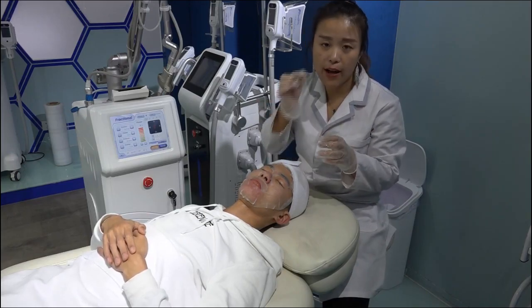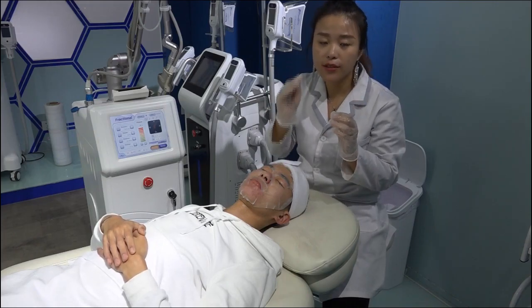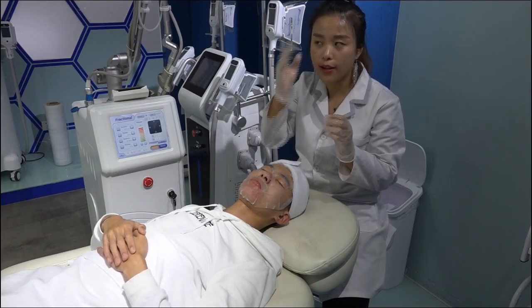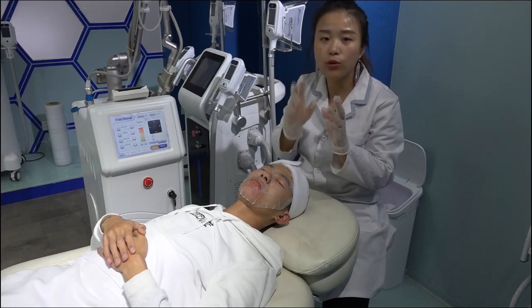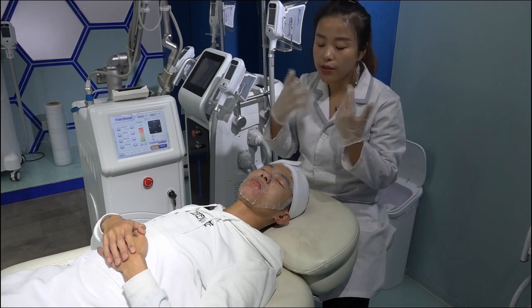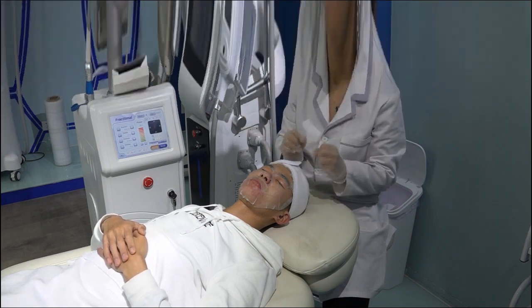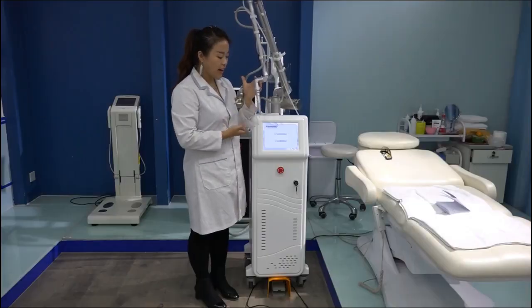And tomorrow you will find a little bit of scab on the skin. And then the day after tomorrow, the scab will fall off day by day. And during 5 working days to 7 days, the skin will recover and the scar will go away. It's okay.